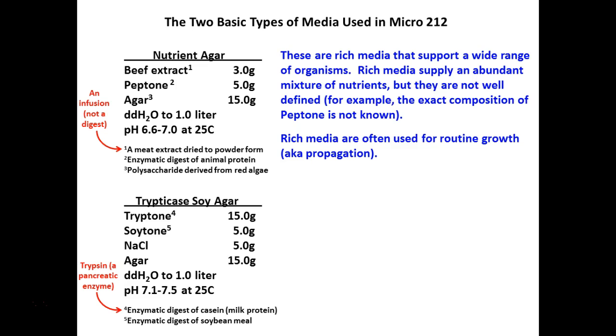No. Right? So they're running out of food, and they're sitting in their own swill. They want out. Over time, they're going to get really unhappy. So when you move them from that fallout shelter they're in right now that's gotten really nasty, and you move them to a new fallout shelter, they're really happy, they have lots of food, they start growing until things get really nasty again. And they pray you come rescue them again, which is what you're going to do every single week. You're going to move them from an older culture to a new culture every week. And we refer to this as subculturing.